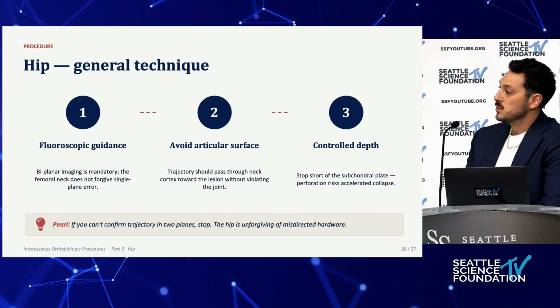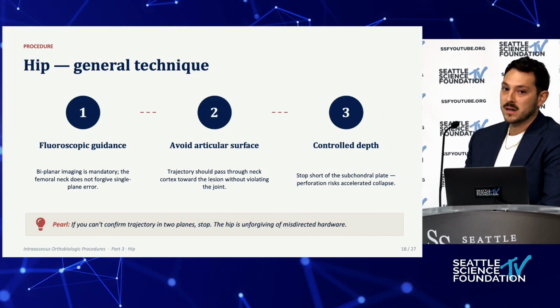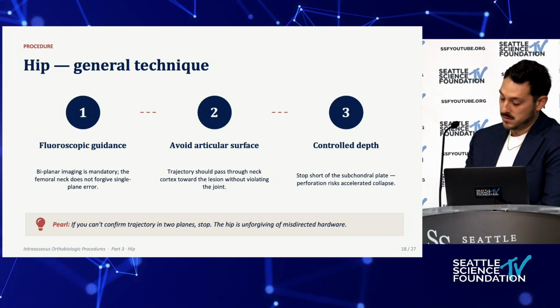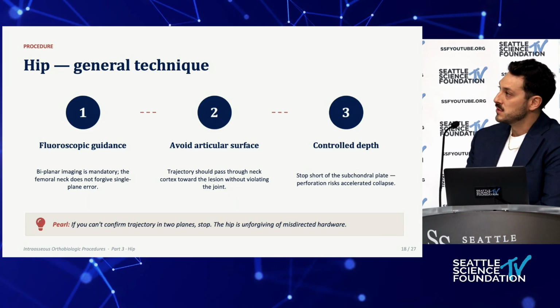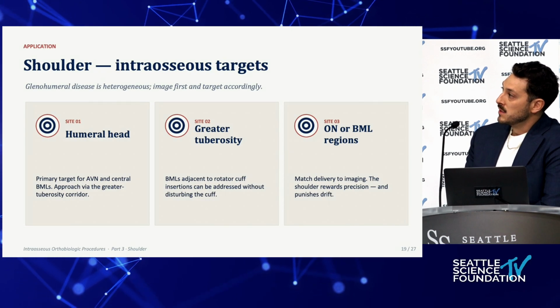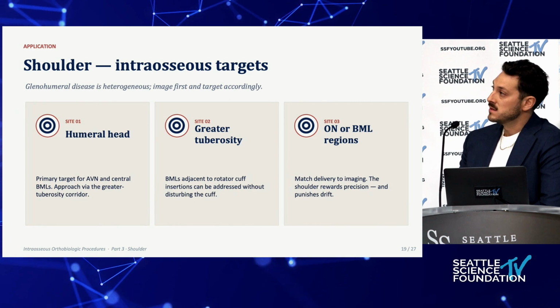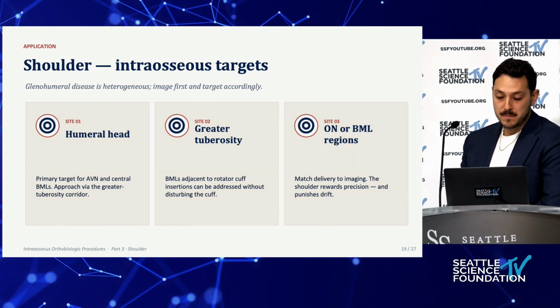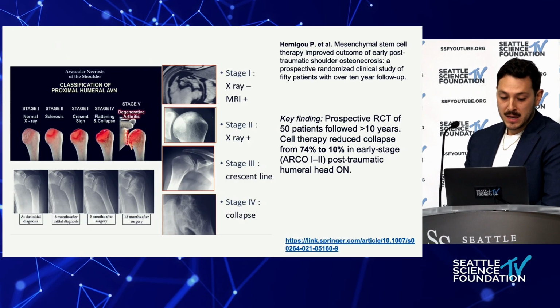Once you are entering the bone under ultrasound, you do want to make sure that you're taking fluoroscopy and make sure that you haven't gone too deep. So always have maybe 2 forms of imaging. And I'll briefly touch on the shoulder. Some of this data is still ongoing. It's not as strong as for the knee or for the hip, but the same principles apply.